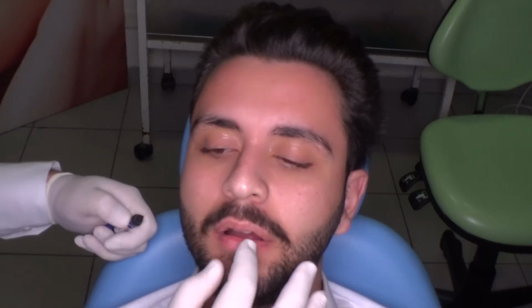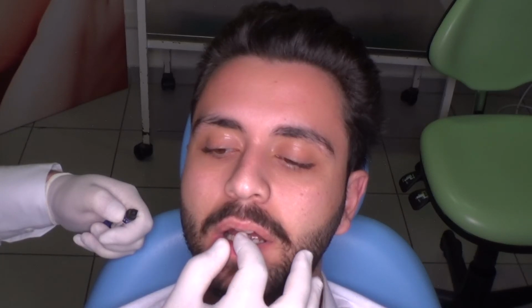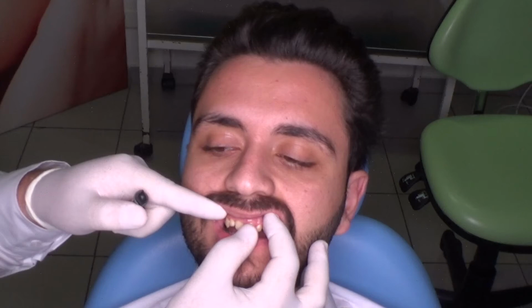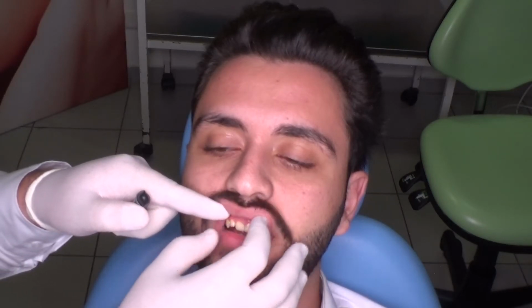As you see, in his case, in rest position, we slightly see the incisal edge position of his central incisor. So we can elongate just half a millimeter. In protrusion, we can add a little bit more to compensate the position of the laterals and the canines. So I take a simple composite, you see. Just take a small quantity.